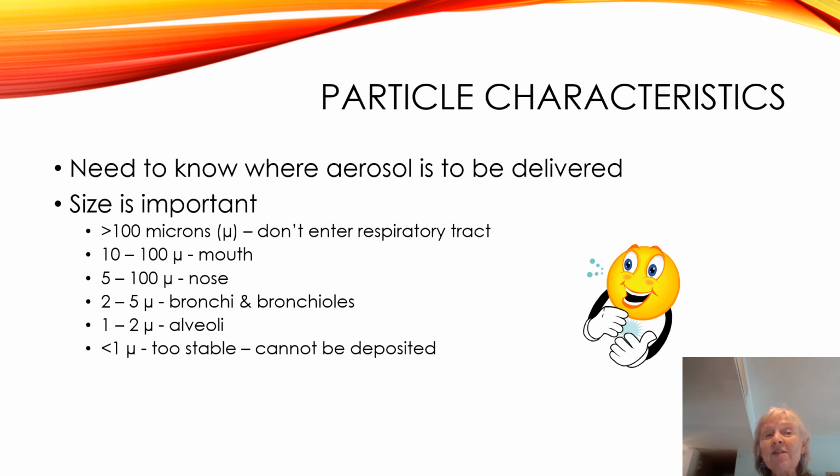The question is, why do we have our patients hold their breath after they take an inhalation? It's because we're hoping that those particles will run into each other, and if they do, that for a small period of time they'll form a particle size greater than 1 micron, and that in fact they will fall out of suspension and fall into the airways to be delivered.